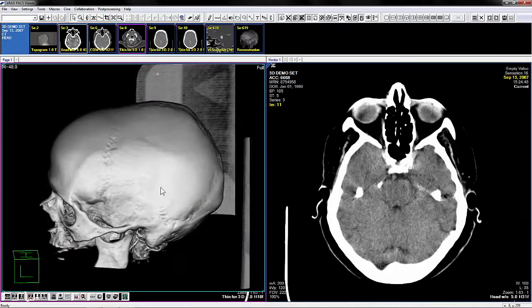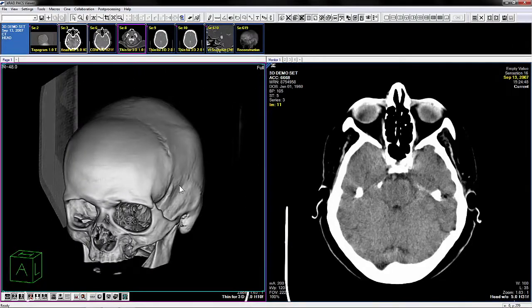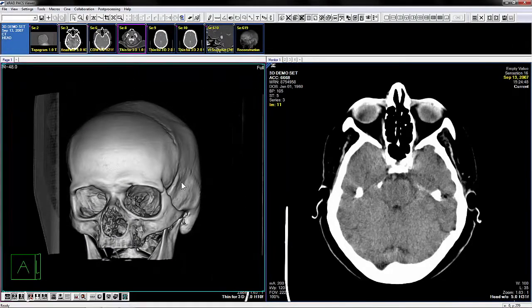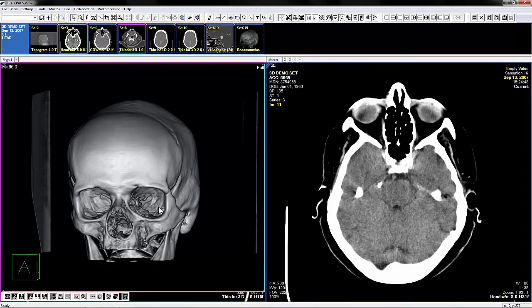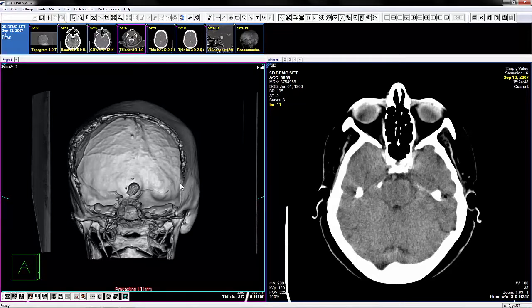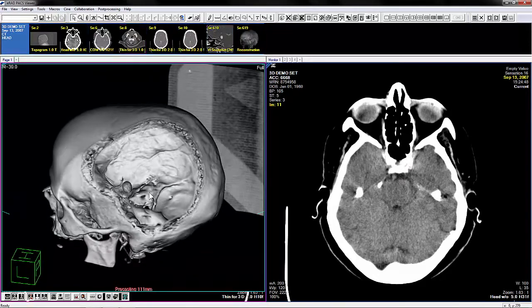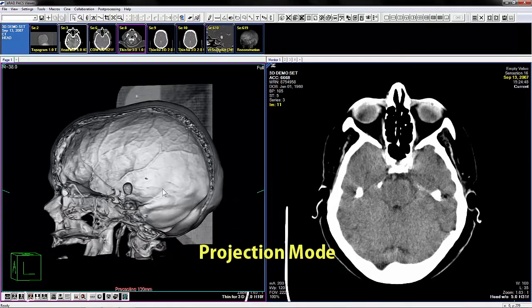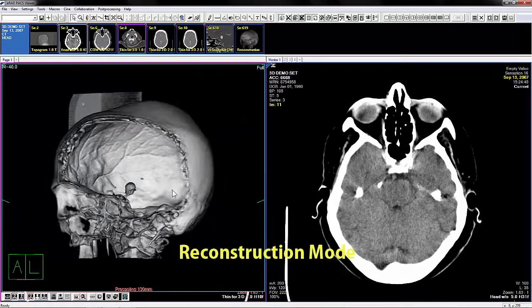The ERAD PAC's volume rendering tool is a plug-in module for generating 3D volumes from 2D datasets. The rendered volume is primarily controlled by combining three components: display orientation, projection mode, and reconstruction mode.